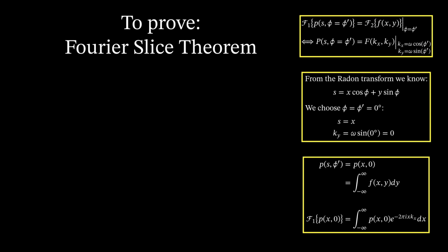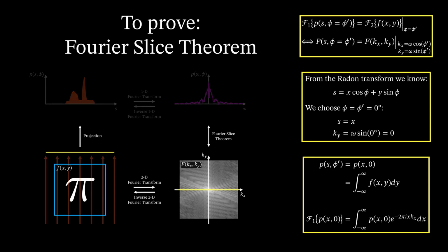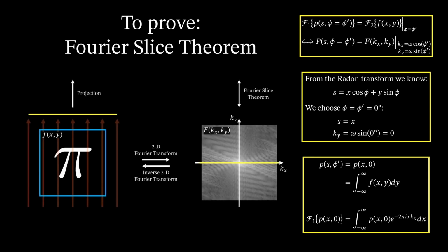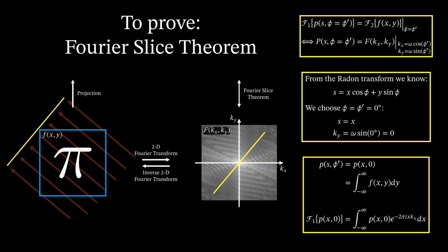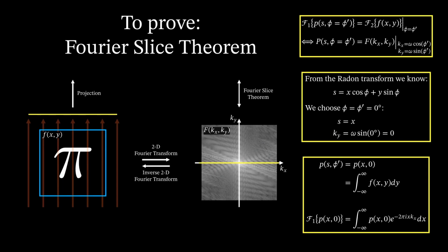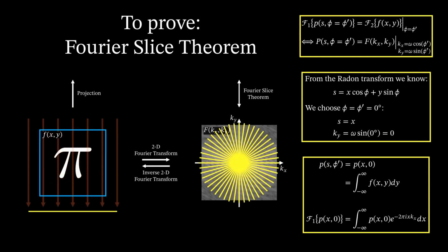To familiarize a bit more how slices look in the frequency domain of the object function at the bottom right, let's zoom into it. When changing the angle phi, the slice in the frequency domain will change accordingly. By showing multiple slices, we see that the center of the k-space contains more data than the outer k-space. It is this exact effect that is compensated by using polar coordinates and accordingly the high-pass filter.